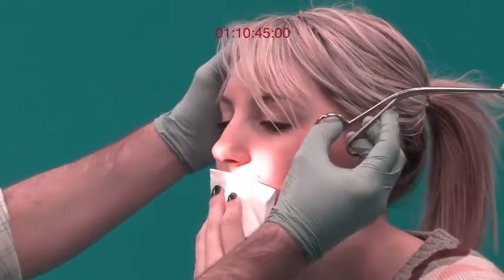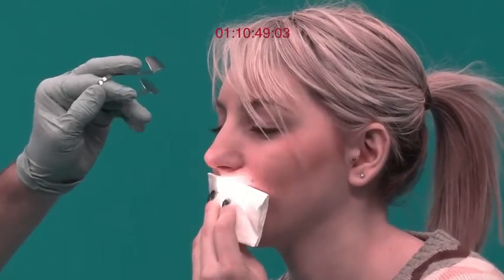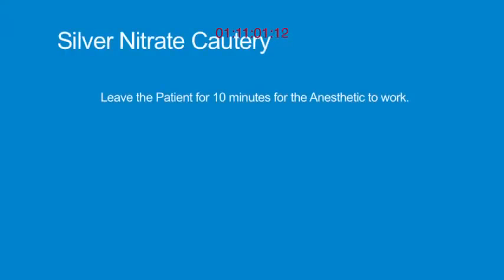In order to avoid developing a numb lip, the patient should be given a tissue to catch any local anaesthetic that may drip out of the nose. Keeping the head level, with the floor of the nose in the horizontal plane, open the nostril with the Thudichum speculum and insert the cotton wool so it's lying against the septum over the bleeding point. Leave the patient for 10 minutes for the anaesthetic to work.